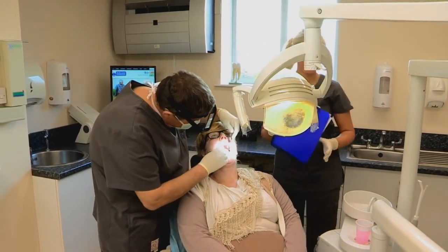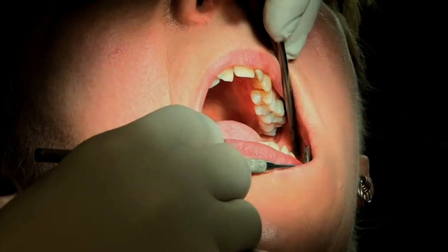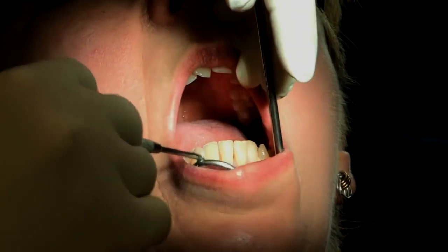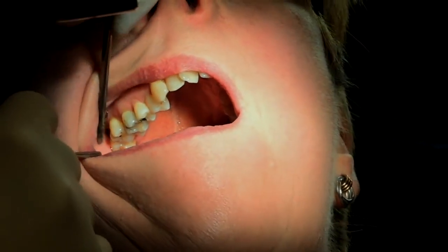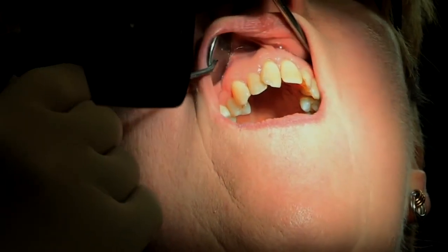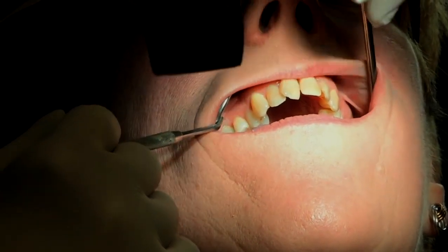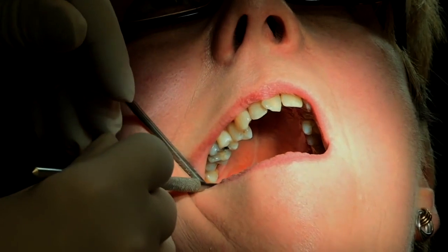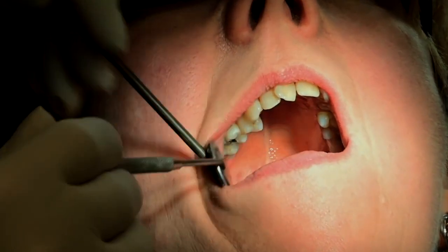Okay, Chloe. The left buccal sulcus looks normal. The left corner of the mouth, the anterior sulcus, the inside of the lower lip, the labial frenum, right corner, right buccal sulcus, upper sulcus, inside of the upper lip, frenum and parotid areas all look okay. Can you just say 'R'? The throat, soft palate, hard palate and incisal papilla look normal.